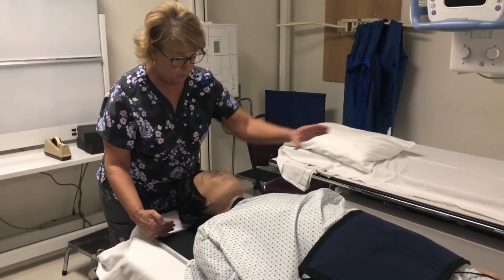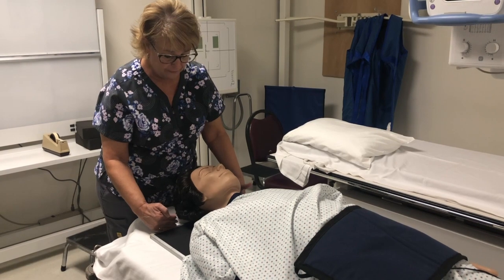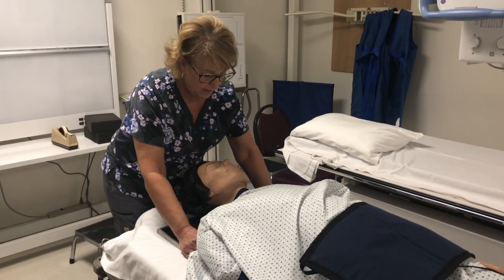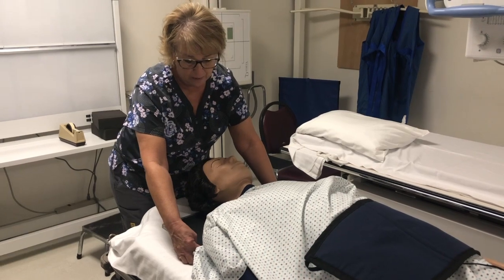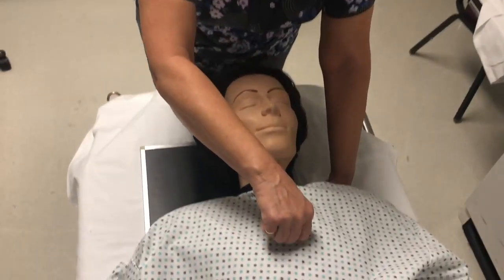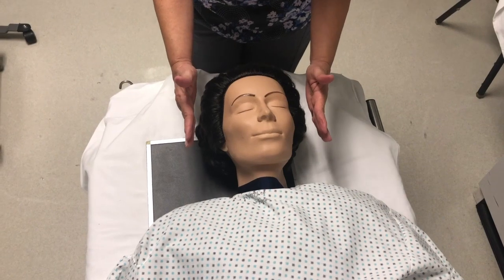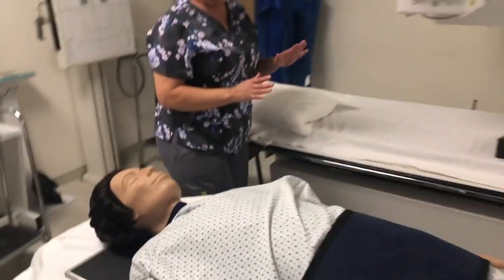And because of that 15 to 20 cephalic angle, I'm also gonna offset the IR upper border. Instead of being at the top of ear attachment, I'm going to move that up slightly too. So right now I'm judging that maybe the bottom of my 10 by 12 is slightly below the jugular notch, and the top of it is about an inch above the top of ear attachment, and then I've offset it this way. So we're gonna do a double tube angulation.